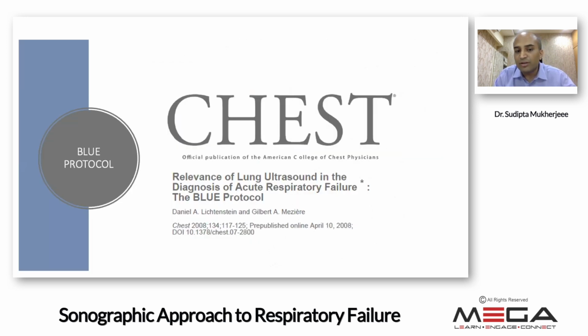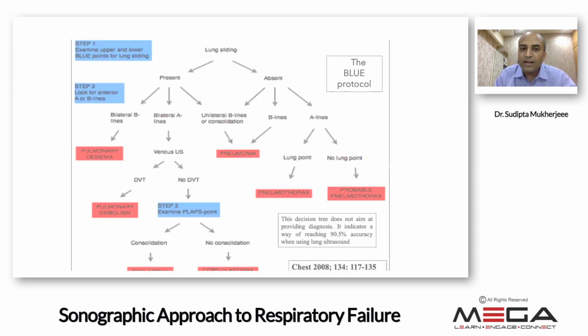And whenever we are doing ultrasound, we need to mention the name of Daniel Lichtenstein, who is called the father of lung ultrasound, who has evaluated different patterns of these ultrasound findings in the lung and tried to give us a protocolized approach, which is called the BLUE protocol. By this structured approach, we can identify cardiogenic or non-cardiogenic pulmonary edema, pneumonia, pneumothorax, and by adding lower limb venous Doppler, we can identify pulmonary embolism also. This is a must-know thing. Every fellow should read the BLUE protocol to have a good understanding of lung ultrasound.